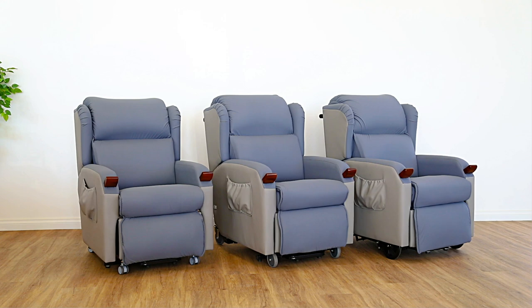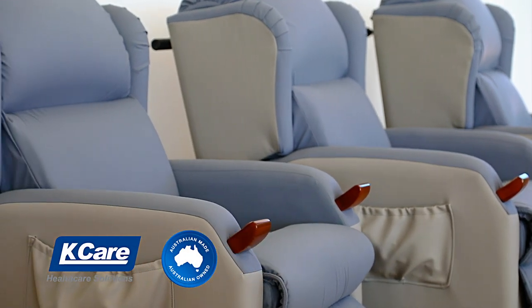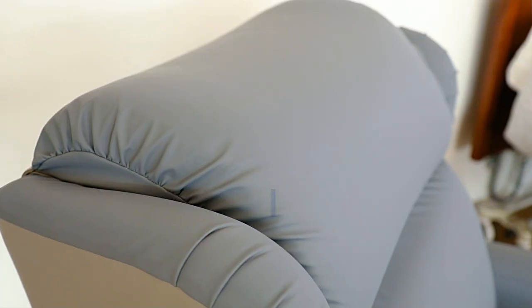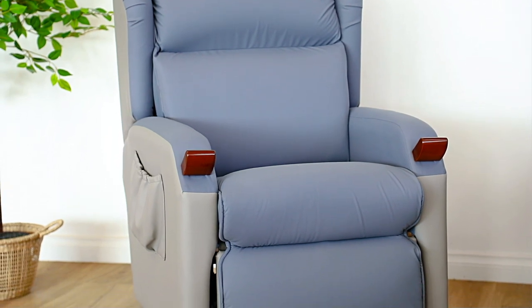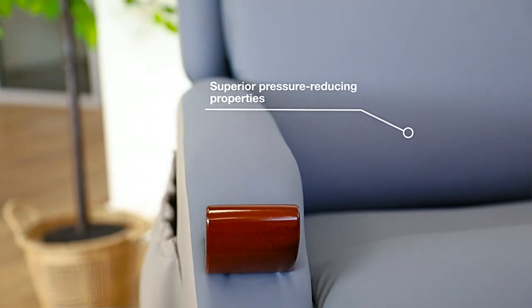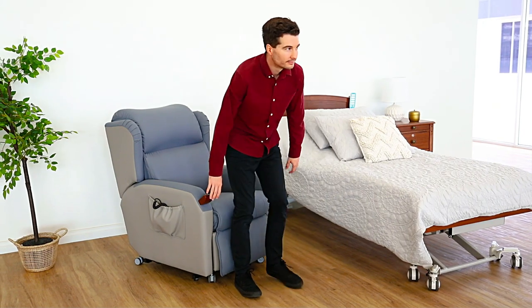The Kcare Air Comfort Compact Lift Chair range is designed and made in Australia to deliver the ultimate in comfort and support for long-term seating. With four air bladders located in the headrest, lumbar, seat, and leg rest, the chair allows for maximum surface area contact, delivering superior pressure-reducing properties and a total surface air pressure system.